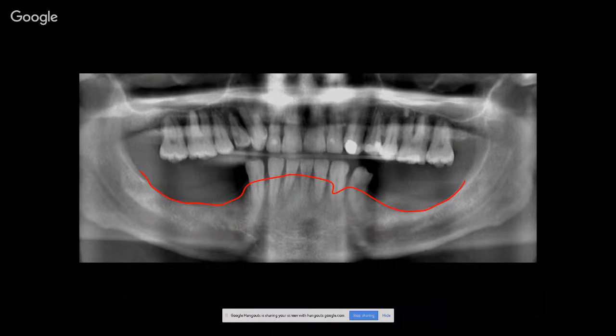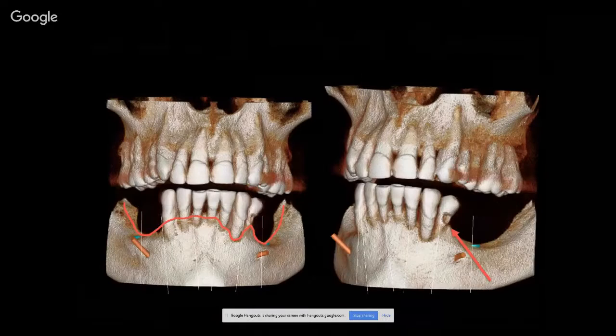He has posterior ridge deficiency and an uneven plane of occlusion. You can better see that on better images, such as these CT images. So the canine in 22 site was completely hopeless, along with tooth number 21. The canine in tooth number 27 site had horizontal and vertical bone loss. So then it was a matter of just removing the mandibular 4 anterior teeth that also had some periodontal disease. And it was a questionable long-term prognosis, and the patient wanted fixed.